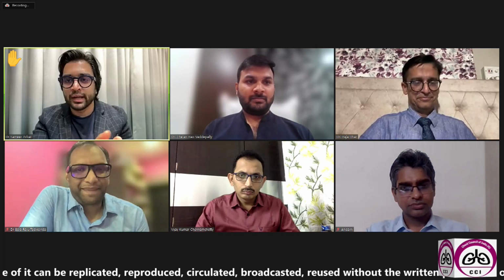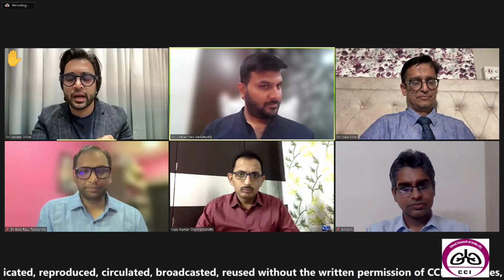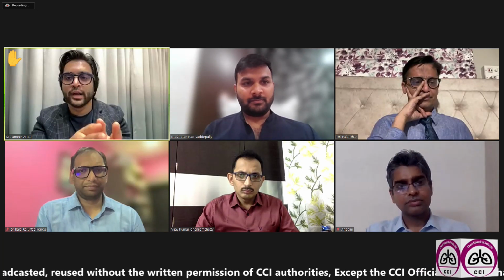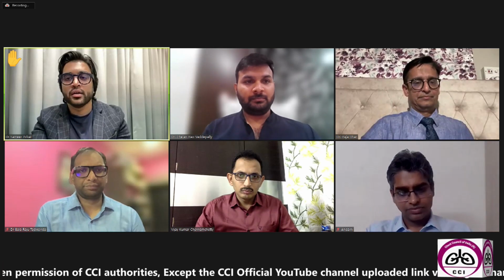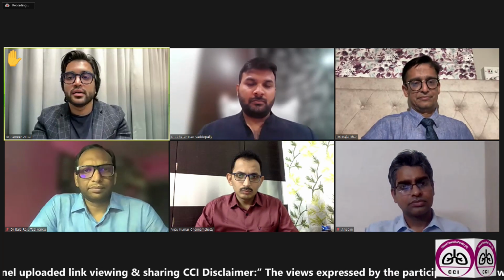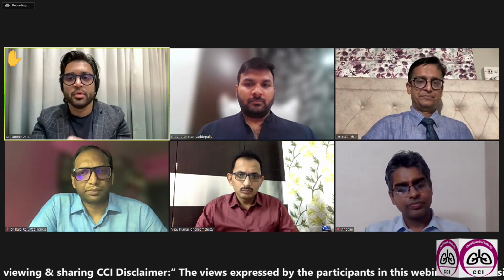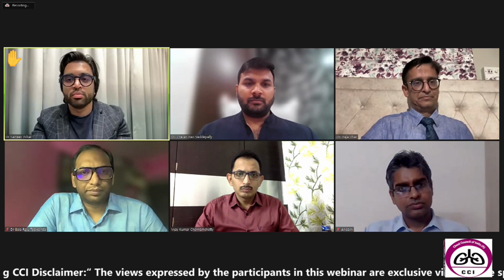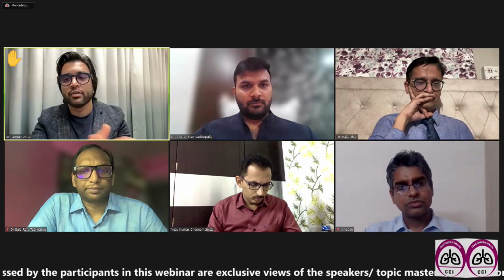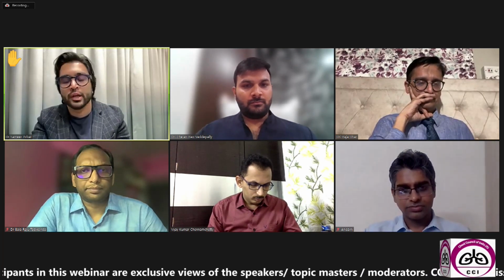And second is how much it requires to set up. The new cryo machine, the Erbe Cryo 2, would cost you around 18 to 22 lakhs. A good rigid bronchoscope and an electrocautery unit will cost you another 2 to 3 lakhs. And since you are using the cryo, it is very much required that you do it not in your basic bronchoscopy suite, but in an advanced bronchoscopy suite or an operation theater where you have the anesthetist and an anesthesia machine, and in case something goes wrong, you have all the resources available for reviving the patient. So the cryo itself will cost around 18 to 22 lakhs, but what you require is an OT setup or an advanced bronchoscopy setup, which means a rigid bronchoscope or an electrocautery to go along with it.